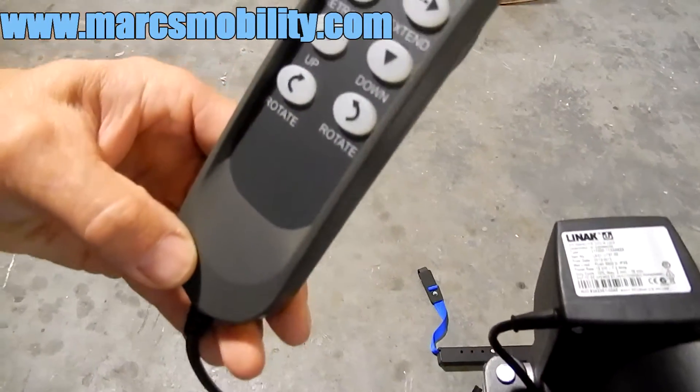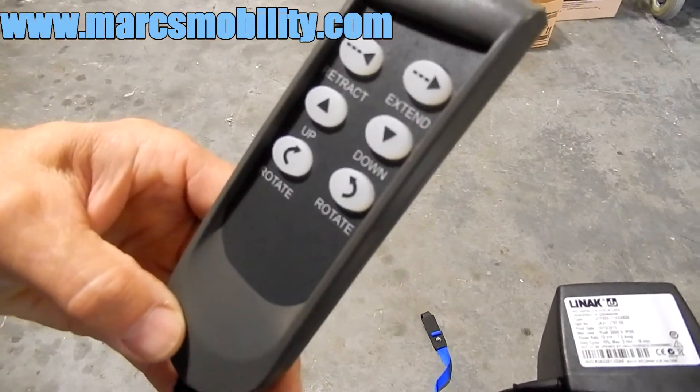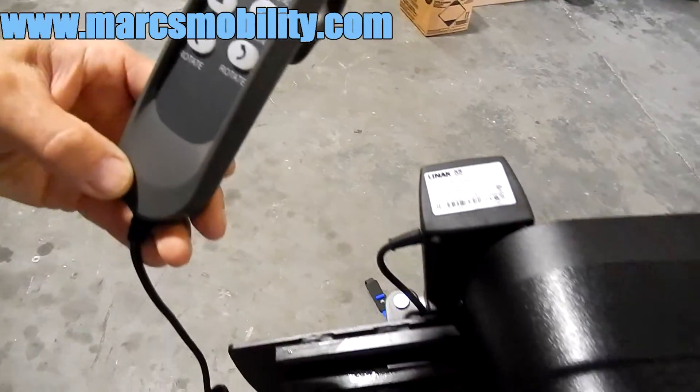This would be your remote, where you have your extension out button, your up and down button, and your rotation button to rotate in and out of the vehicle.